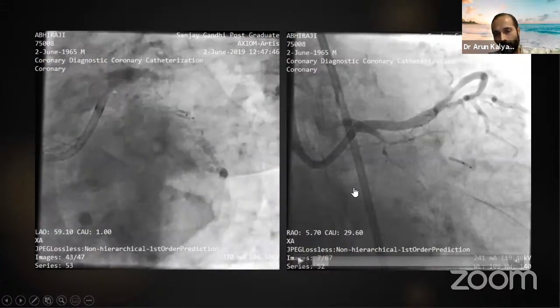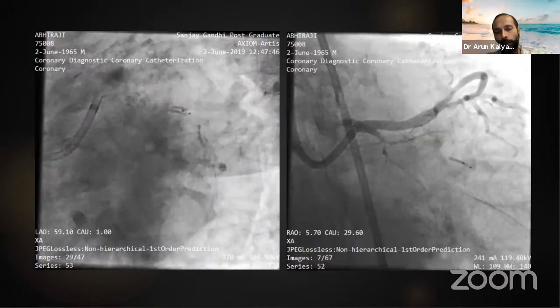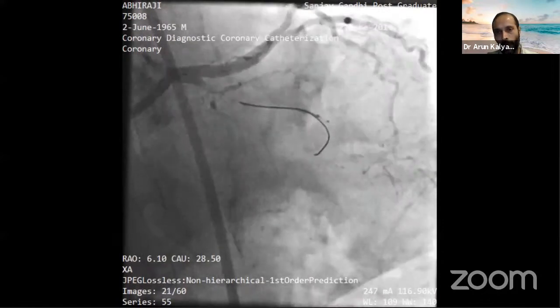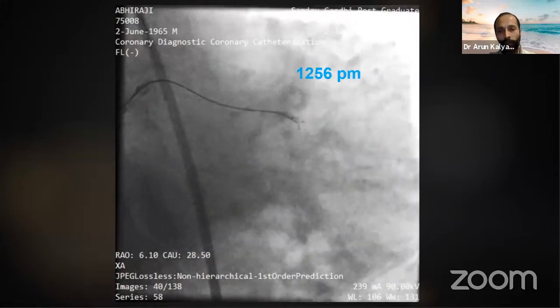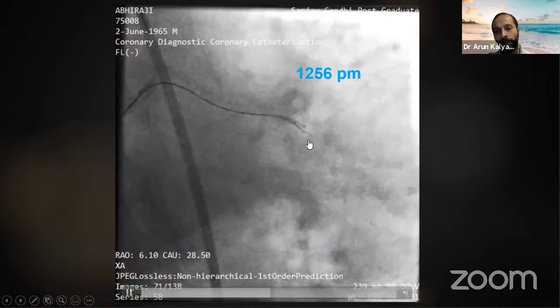And so we had done some straw through the microcatheter and through the Stingray balloon itself, but it still wasn't really helpful. And again, this is where the experience part comes in. So 30 minutes after we decided to knuckle, this ended up being a stick and drive. So this is the proximal port through which the Conquest Pro 12 wire was in.